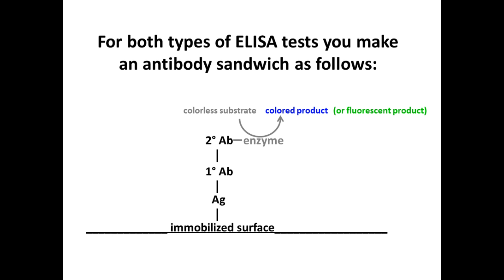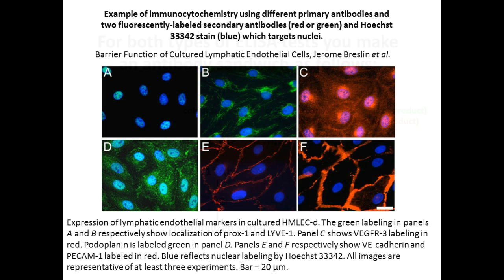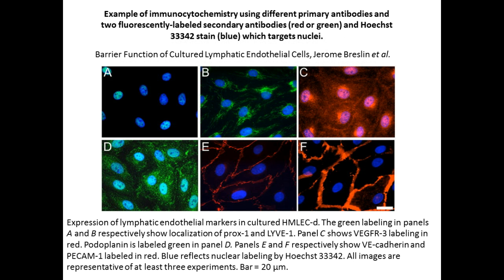This type of technology is used a lot in research, as well as we've already listed all the commercially available and in doctors' offices quick rapid tests. Sometimes the product can even be a fluorescent product, or chemiluminescent products where they luminesce because of the chemicals. And I have in my office, I don't want to take it down off my wall, but Peter was kind enough to find a really cool picture. And so there are lots of labeled antibodies that are utilized with specific stain colors associated with them.